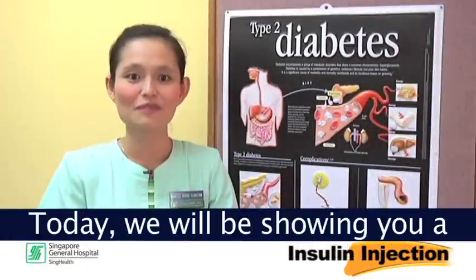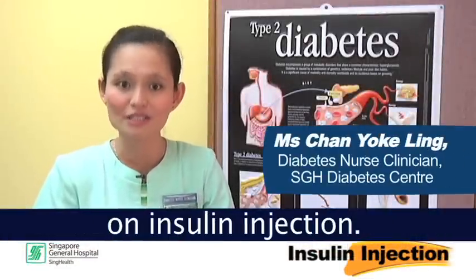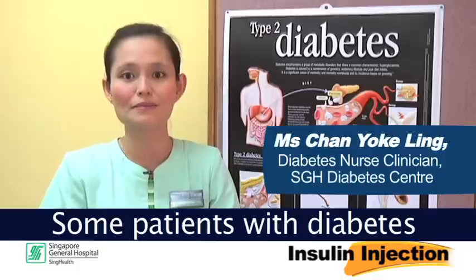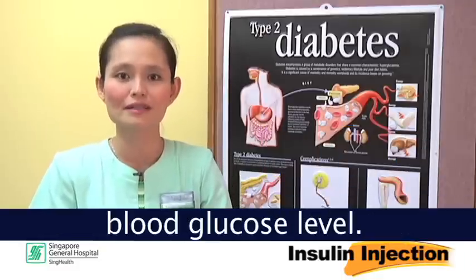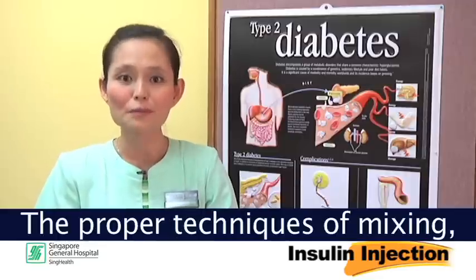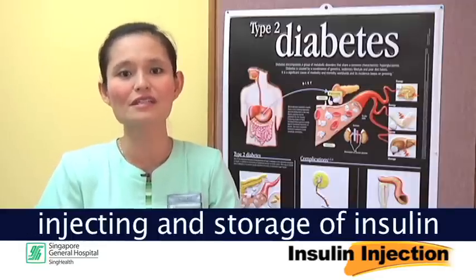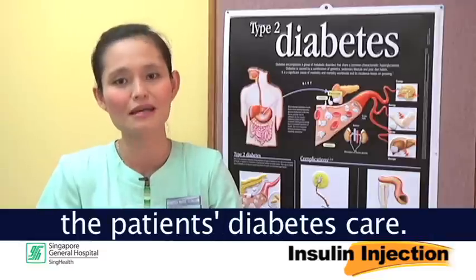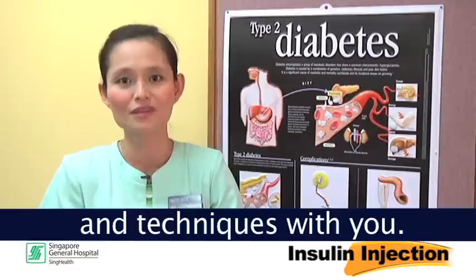Hello everyone. Today we will be showing you a step-by-step instruction on insulin injection. Some patients with diabetes will require insulin injection to control their blood glucose level. The proper techniques of mixing, injecting and storage of insulin are crucial in the patient's diabetes care. Let us go through these principles and techniques with you.